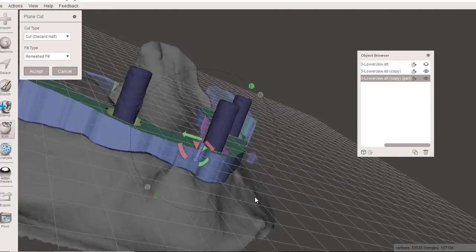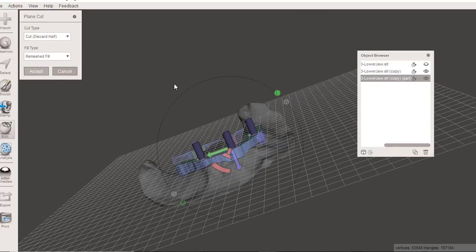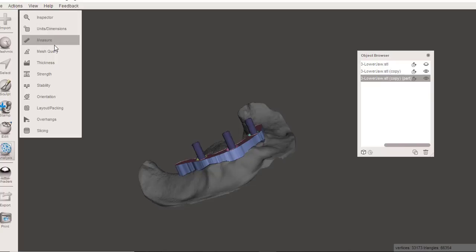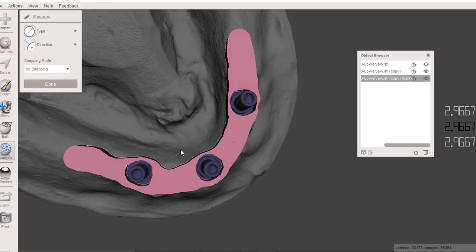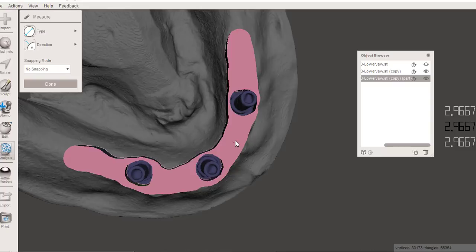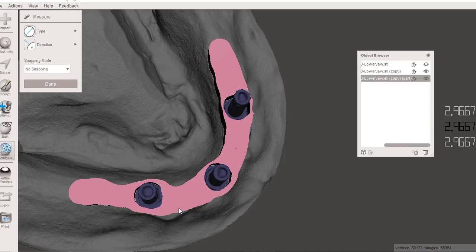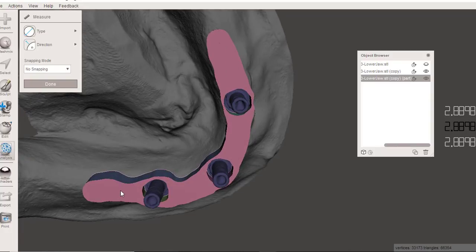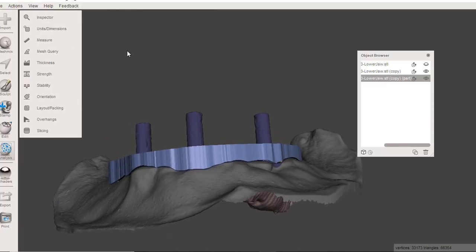All right, that at least appears to have that. And if I accept it, I could go into the analysis tools and measure. And now when I click here, I've got this type of a measurement tool selected. If I click right there, which I think was probably the thinnest area, maybe right over here, that looks like 3 millimeters. Right here is 2.6, 2.8, measuring all around 2.5. I've pretty consistently got 2.5 to 3 millimeters of thickness all over this thing. So that's acceptable for what I'm going to do.